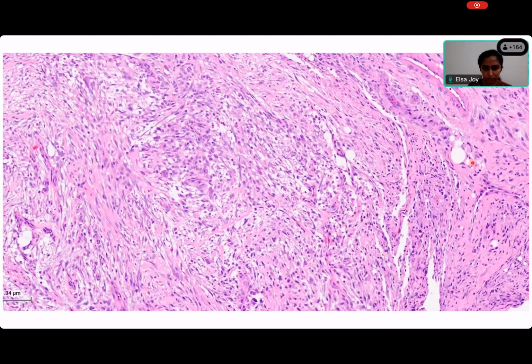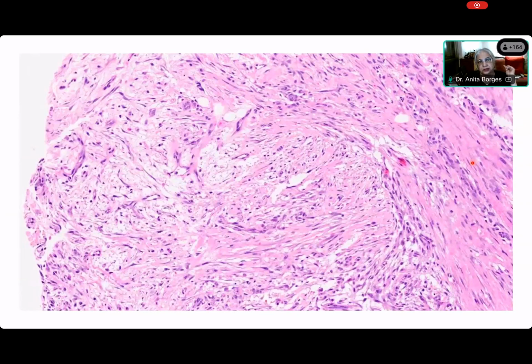Now come on, describe this. What is the principal cell that you are seeing? Just look at the cells, ma'am. Spindle shaped cells. Okay. You said spindle shaped cells. What about here? You see collagen, yes. But we're talking about cells. There is collagen, there is myxoid, but we're talking about the cells. So describe the cell. What is the principal cell over here? There are also stellate cells. Stellate cells. So you have got two kinds of cells, Elsa. That's excellent. You've got spindle cells and you have got stellate cells.